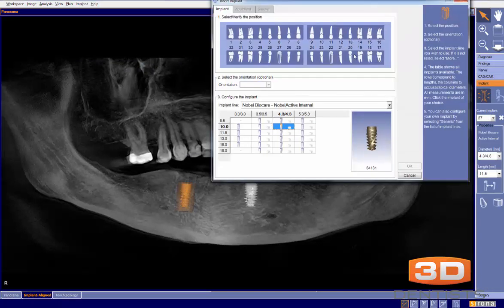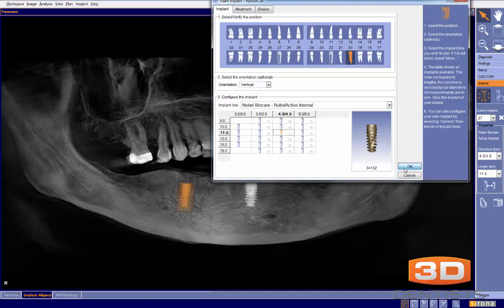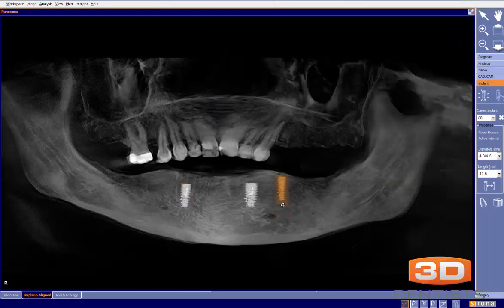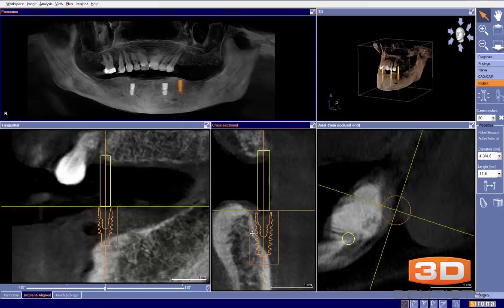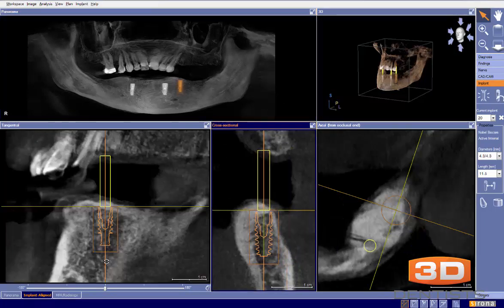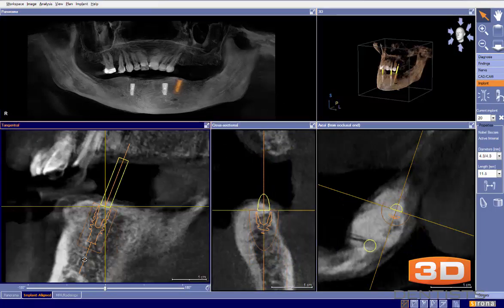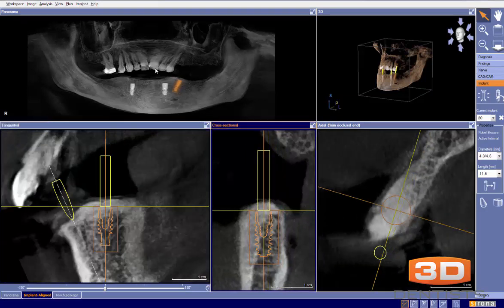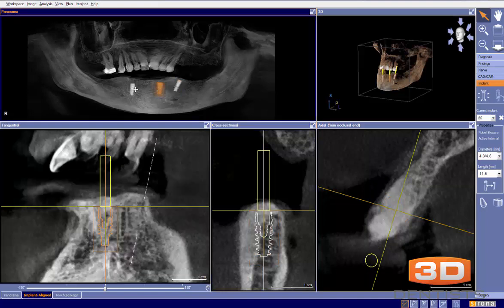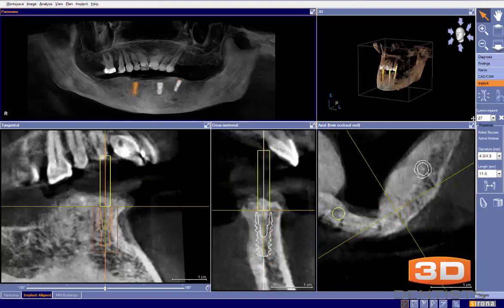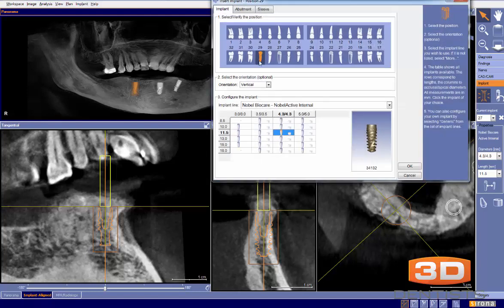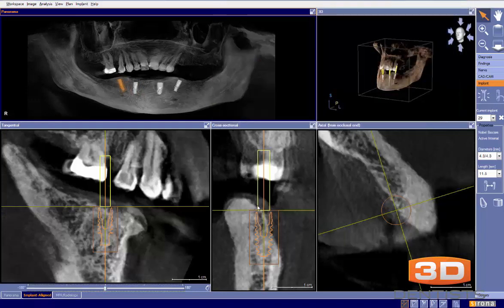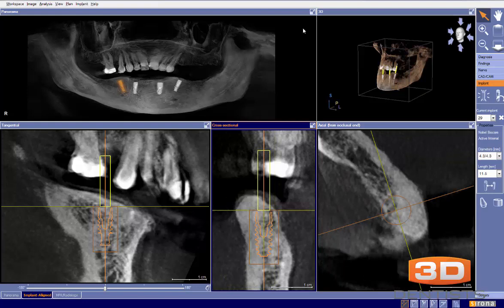To make it a bit easier, I'll roughly plan these implants — probably at about a 30-degree angulation — then move that one over a bit, and go ahead and place one in the 29 spot. Just like so. So there we go — roughly planned.